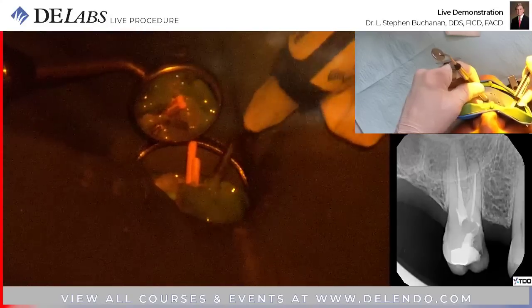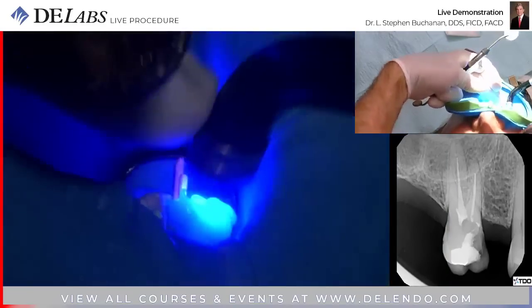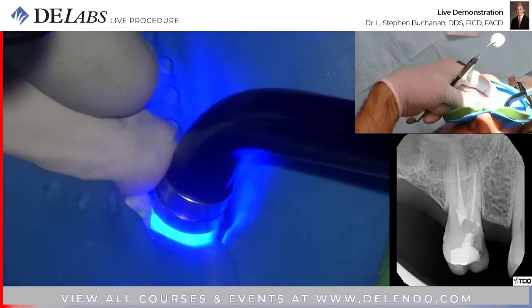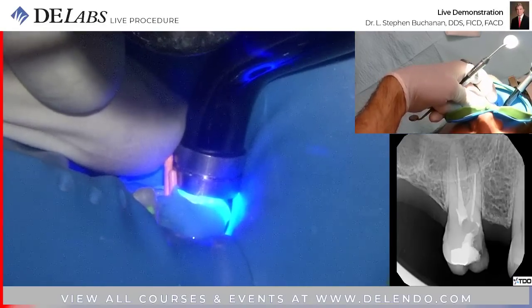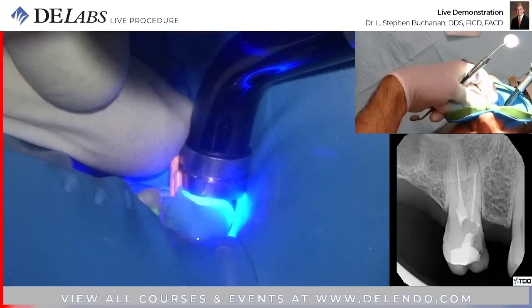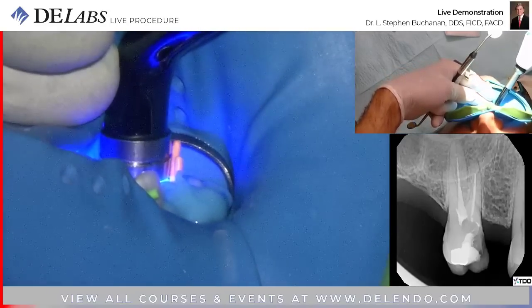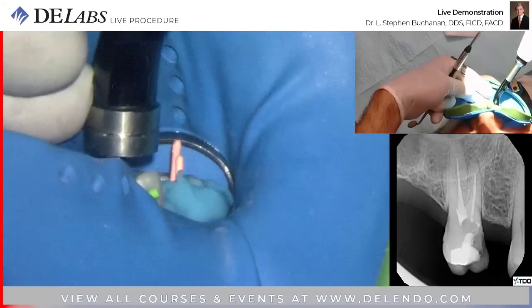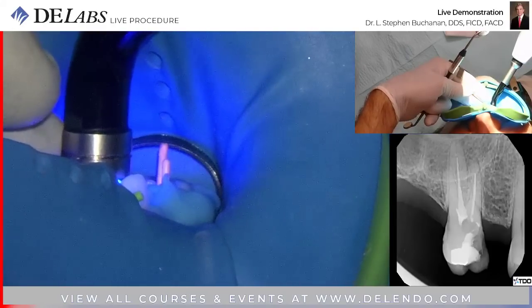So basically, I have to create a custom gasket around this tooth so that I can create a negative pressure environment inside of it. One of the most clever parts of this design is that it creates a Venturi effect by blowing the solutions back towards the procedure instrument, and that's what creates the negative pressure. That's what makes hypochlorite use in a tooth totally safe, because there's no positive pressure.